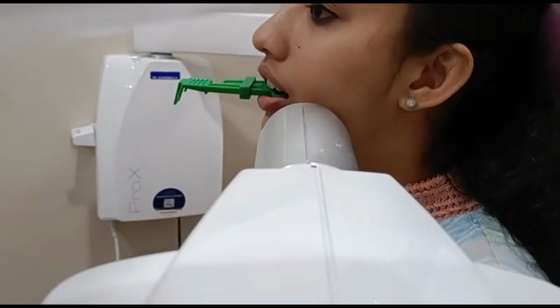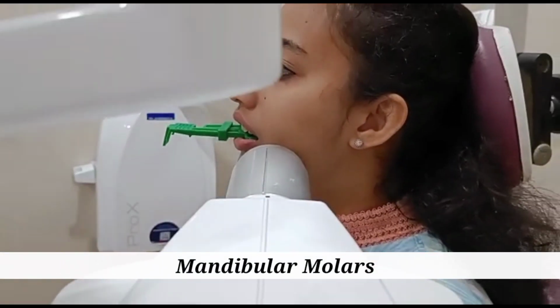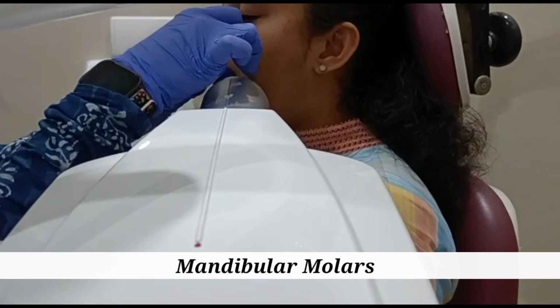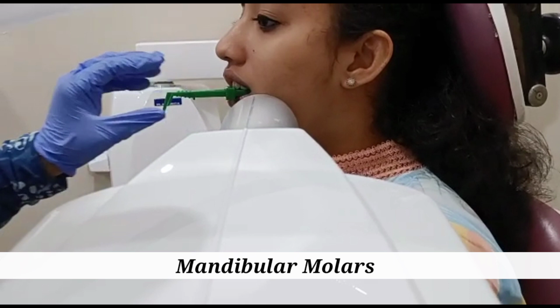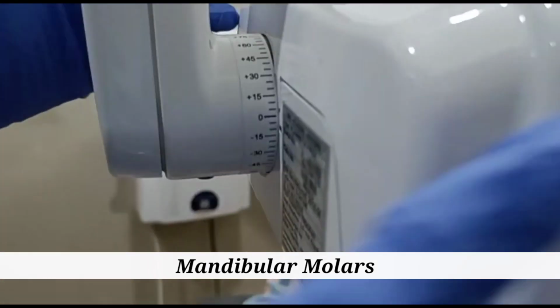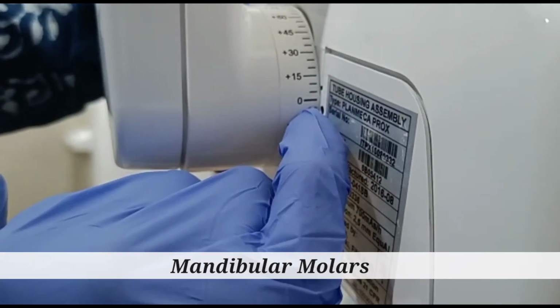Now we place the image receptor quite posteriorly such that we get the middle part of the second premolar till the distal aspect of the third molars, and we give a vertical angulation of -5 degrees.